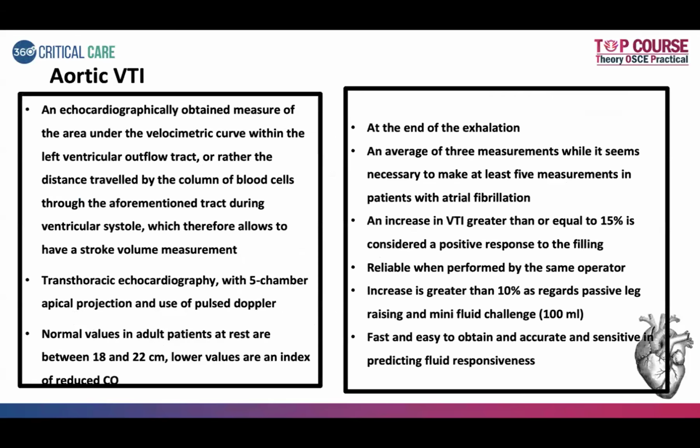So coming on to aortic VTI, which we were telling before, it is an echocardiographically obtained measure of area under the velocimetric curve within the left ventricular outflow tract, or rather the distance traveled by the column of blood cells through the tract during the ventricular systole, which therefore allows us to have a stroke volume measurement.